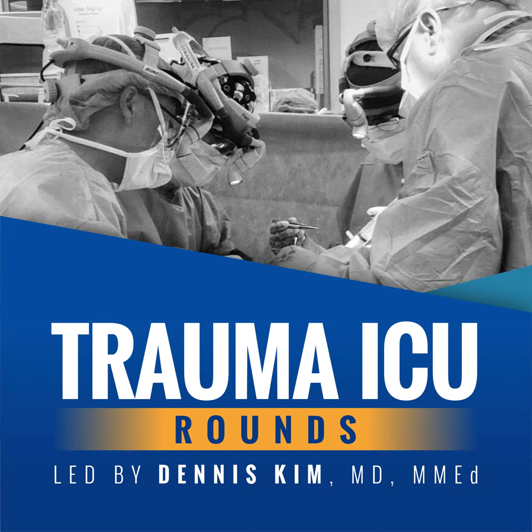So today we're going to be discussing modes of ventilation in follow-up to episode 3, in which we laid the groundwork or fundamentals for understanding mechanical ventilation. And as you may recall, we discussed the respiratory equation of motion, which states that the combined pressure generated by the patient and ventilator, that is, the negative pressure generated by the muscles of respiration, or P muscle, and the positive pressure delivered by the vent, or P vent, must be greater than both the resistive and elastance forces in the lungs and chest wall in order to produce motion or flow to deliver a volume of gas into the lungs.